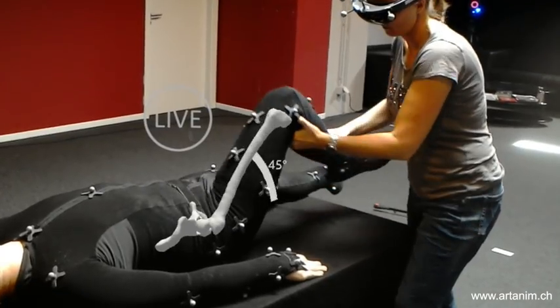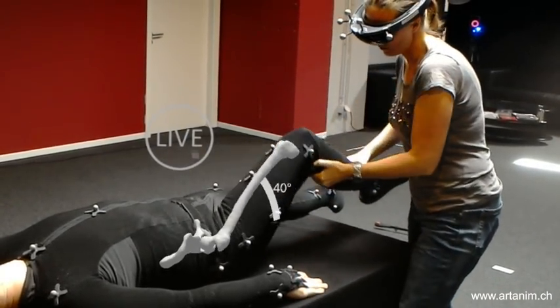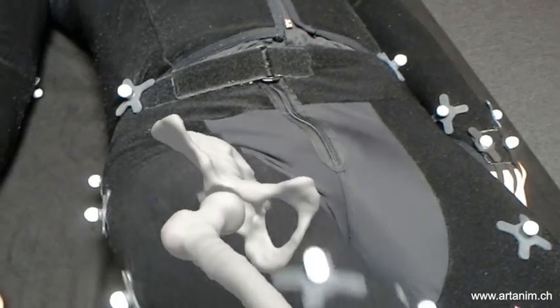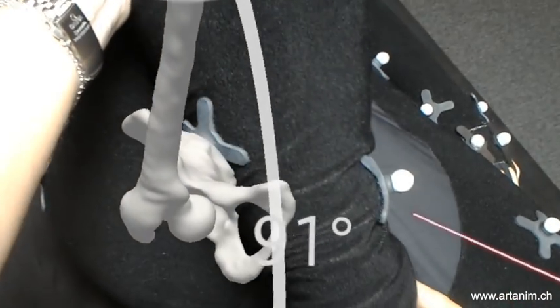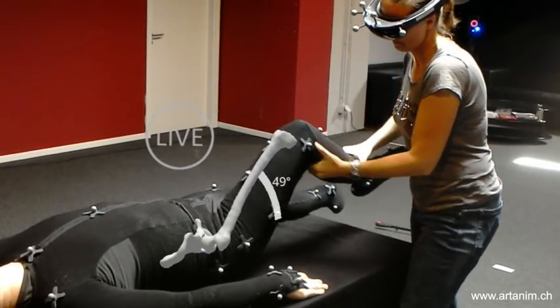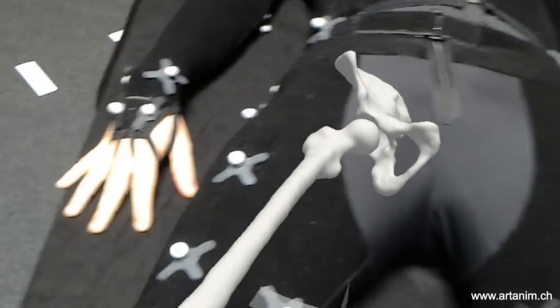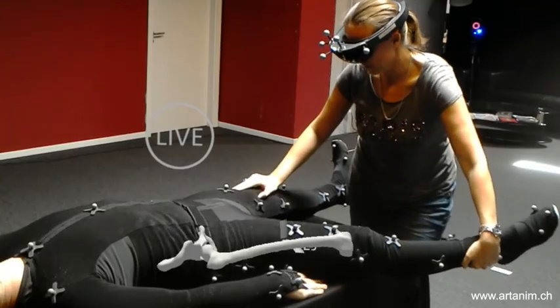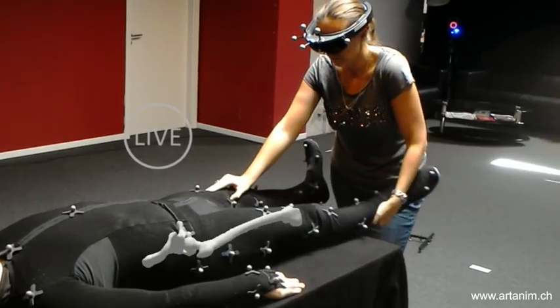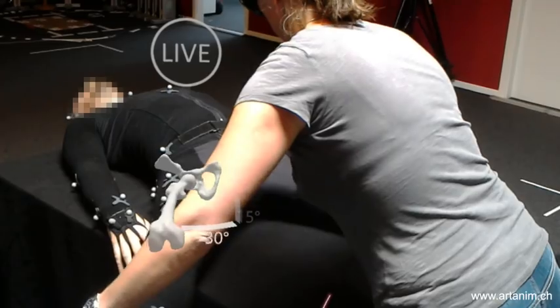Our application can be used during physical examination to qualitatively and quantitatively assess the range of motion of the joint under investigation. As the patient performs a specific task, the system provides the current amplitude of the joint, such as the amount of flexion or abduction. During that process, the clinician can also have a closer look at the joint and visualize any abnormal behavior.